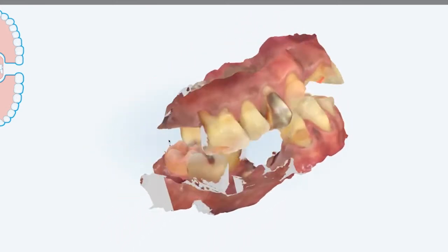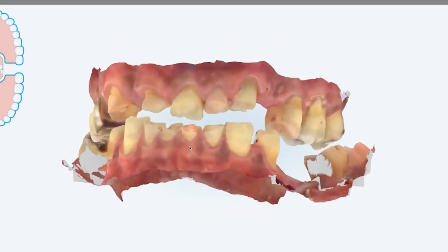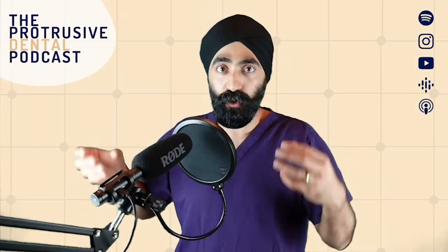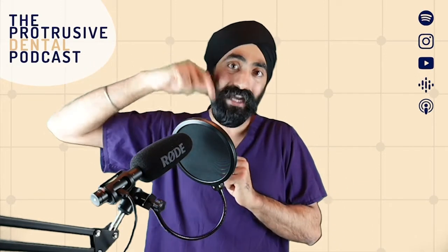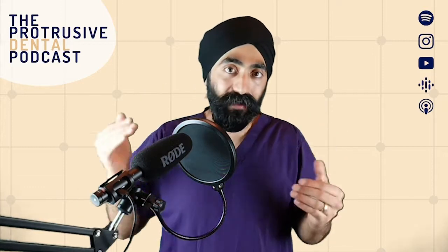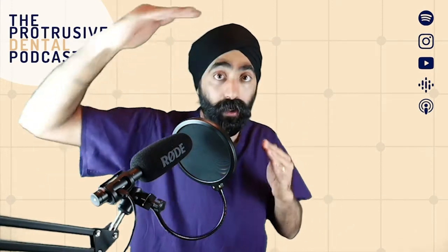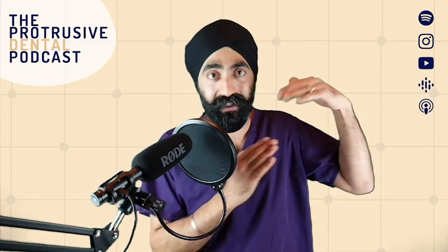Now, the problem is, and you'll suss this out in the episode as well, something I've already touched on in the very beginning of this intro: the articulator is not the person. So if you change anything vertically on the articulator, there's no guarantee, in fact it's definitely not happening, that the patient also opens in the same arc, okay? The arc of the patient is likely going to be different, even with the best Facebow in the world, to the arc on the articulator.